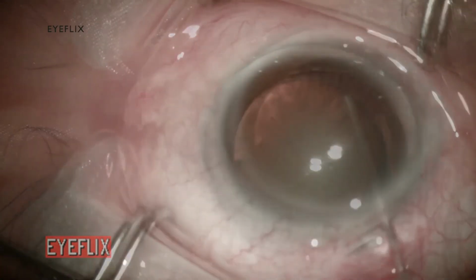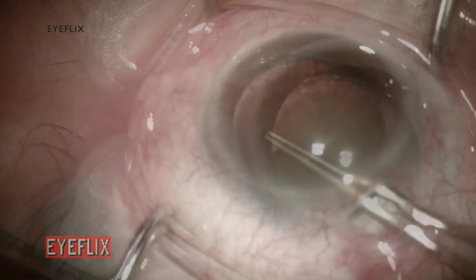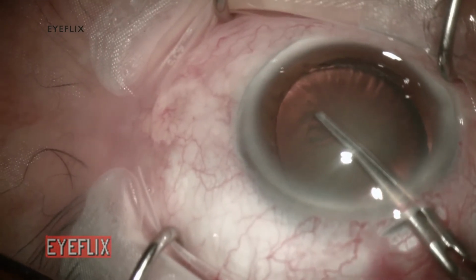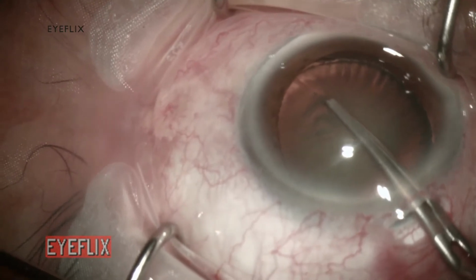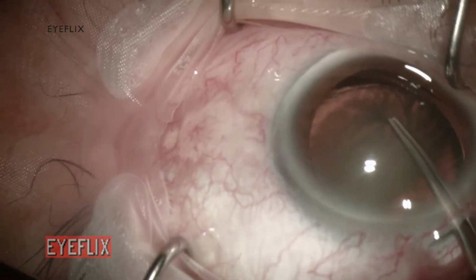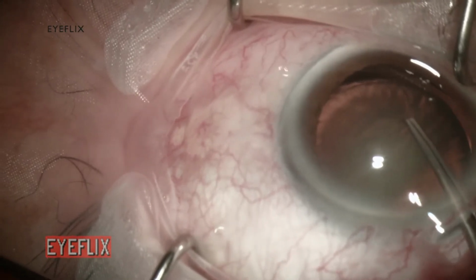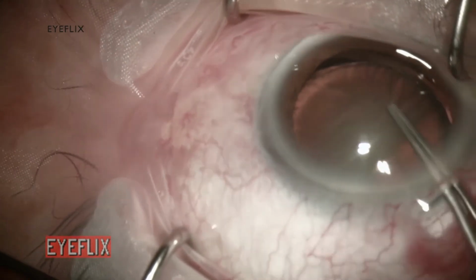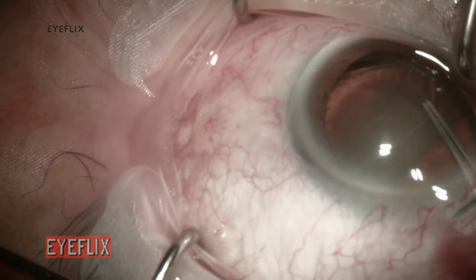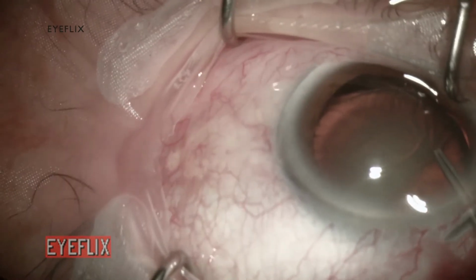I used dispersive viscoelastic to tamponade the area of dialysis. I find it preferable to start the capsulorhexis in the quadrant that has the best zonular support, since it will be easier to puncture through the capsule in that area. You can see the folds that appear in the anterior capsule as I proceed with the rhexis. This is a typical sign of zonular weakness.